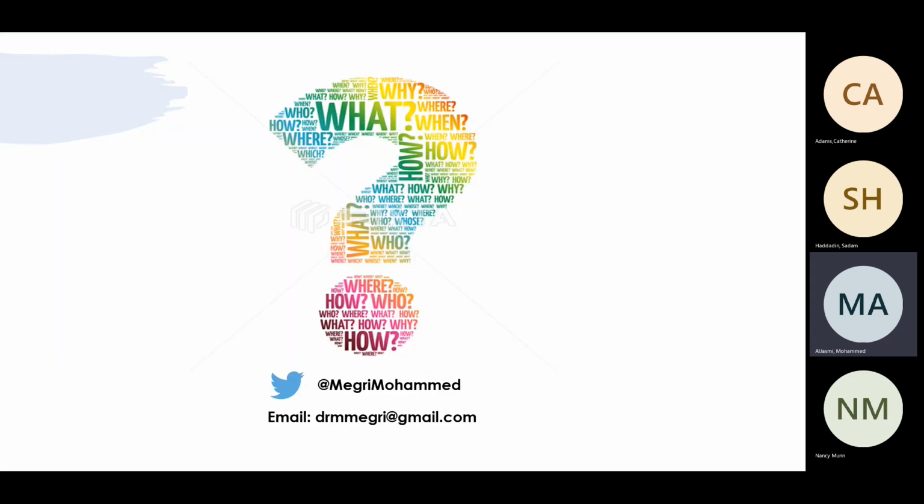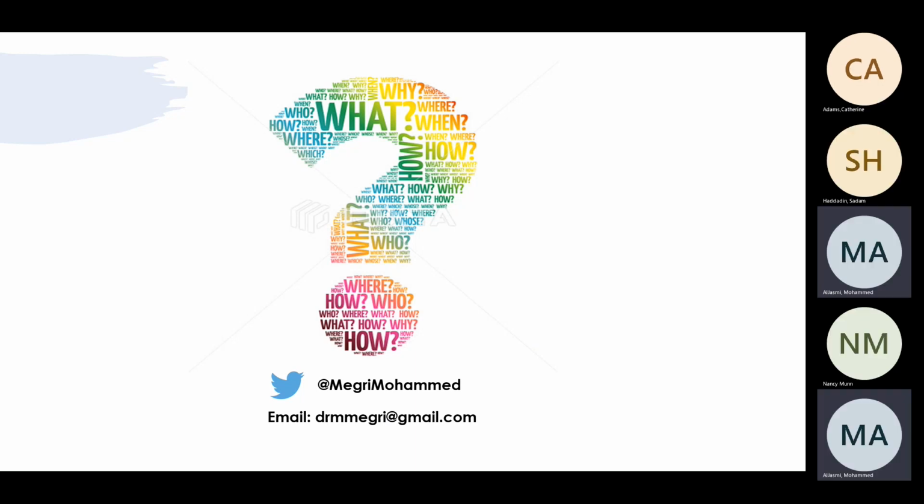And is it still the set point because the patient initiates and the patient ends, or is it another? The set point is not about who's ending or who's controlling the machine. The set point means that I'm the one who asked the machine to end the respiratory breath at this time. I give it a specific volume and time. But if I said, hey machine, you can stop whenever you want by looking at this.